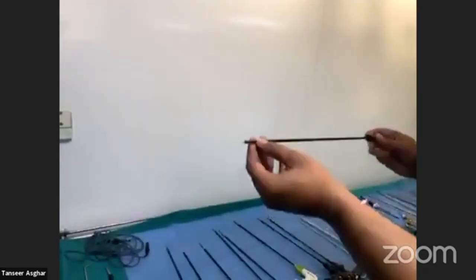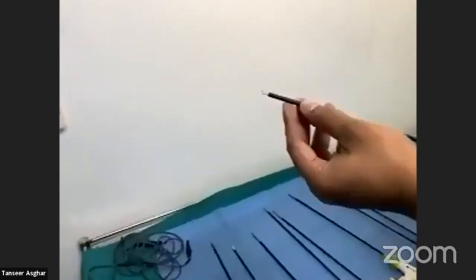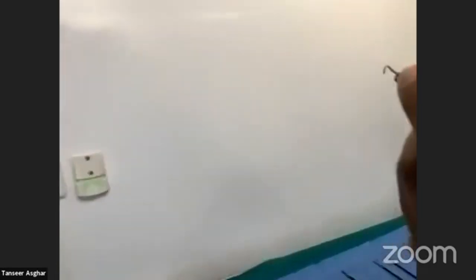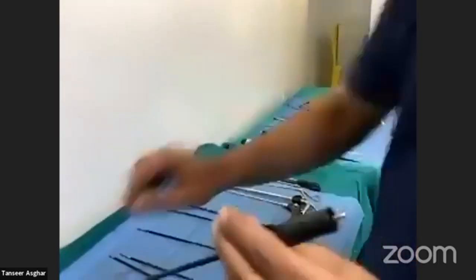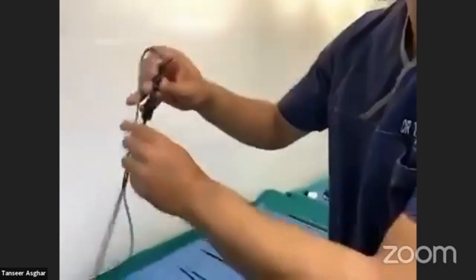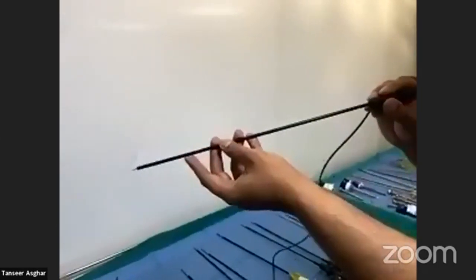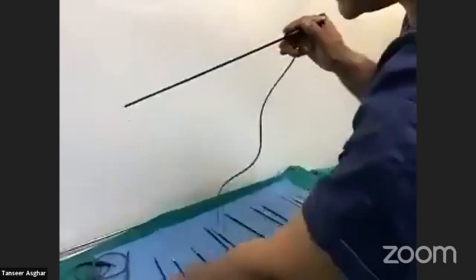This is another important instrument called the L-hook. You can see the L-type tip. You can use it for cautery and it has an end where you can attach the lead of the cautery. It is used in laparoscopic cholecystectomy and can be used in almost all laparoscopic surgeries.